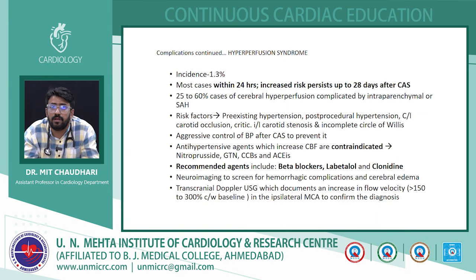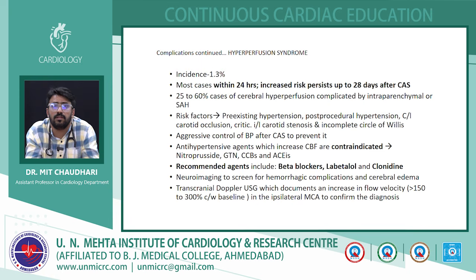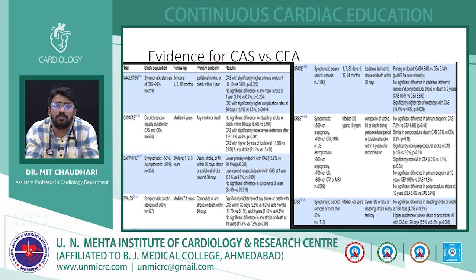Risk factors for developing cerebral hyperperfusion are perioperative uncontrolled hypertension, post-procedural hypertension, or contralateral carotid artery occlusion as well. If you open up this artery, the cerebral circulation is already chronically ischemic, and with the opened artery there is increased cerebral blood flow, which can result in cerebral hyperperfusion. But fortunately, this is a very rare complication, occurring in 1 to 2% of the cases. In-stent restenosis is a late and very rare complication.